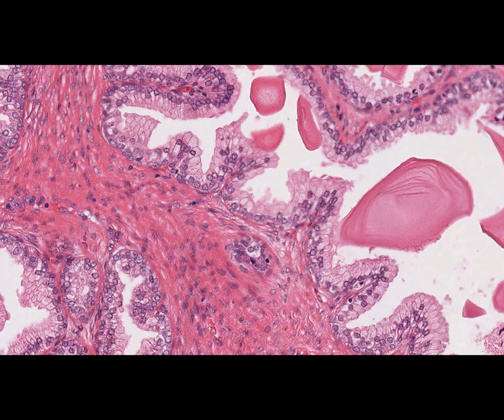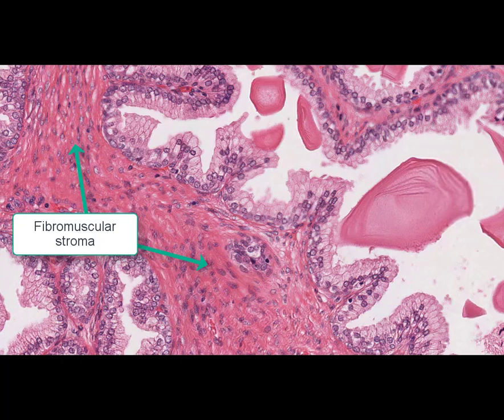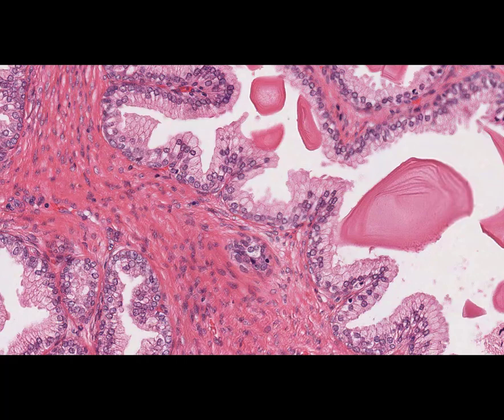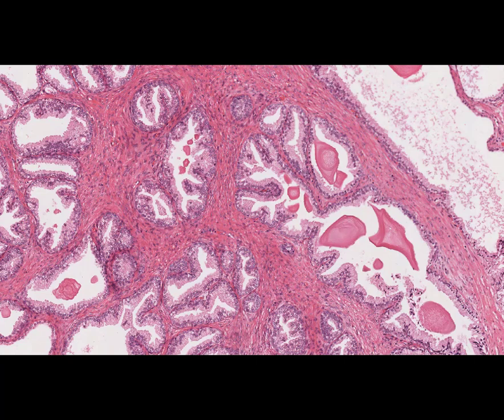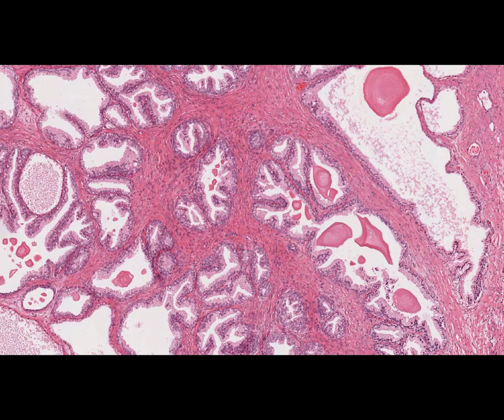Also, there is a proliferation of hyperplastic fibromuscular stroma of the prostate gland, and it may contain some features of chronic nonspecific inflammation in the form of lymphohistiocytic infiltration. The most important complications and outcome of this condition are related to the violation of urine outflow, ejaculatory function, as well as possible malignancy process.